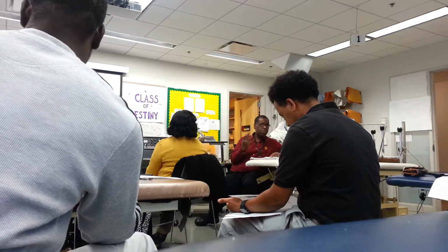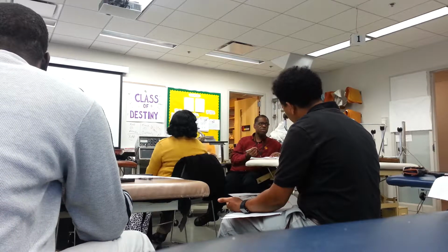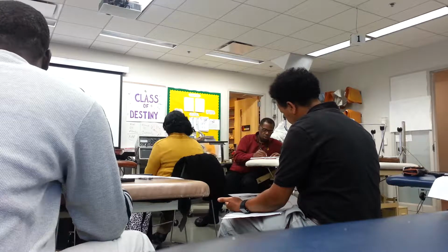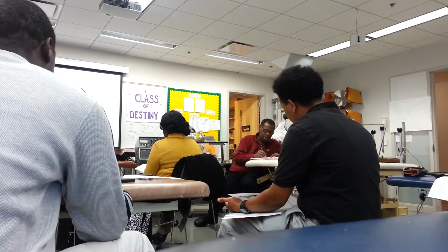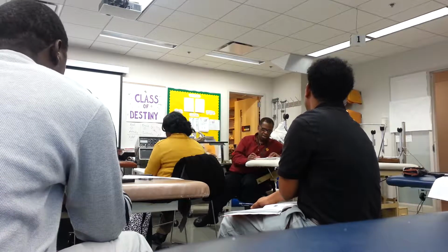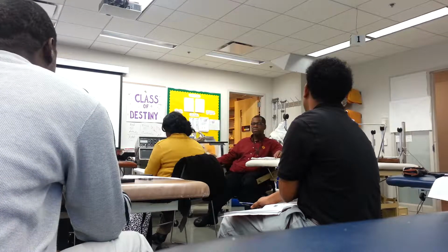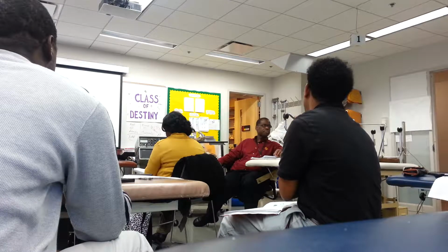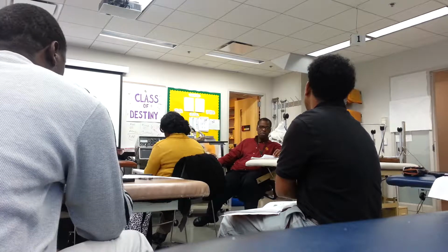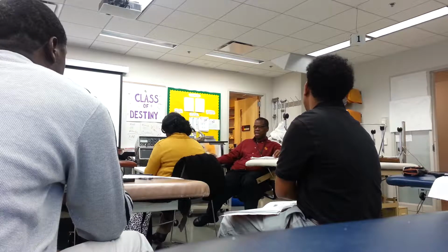Then, let's say I'm treating this wound, and I have a monopolar setup. Monopolar refers to what? Or polar refers to what? Pads. All right. Now, what do we mean by monopolar? One active, one dispersive. So how do you know a pad is active, and how do you know a pad is dispersive? The dispersive is twice the size of the active, or the active is less than, more than half. Yeah, good.